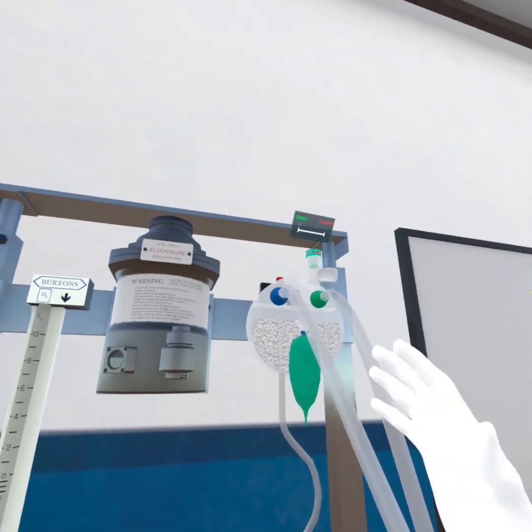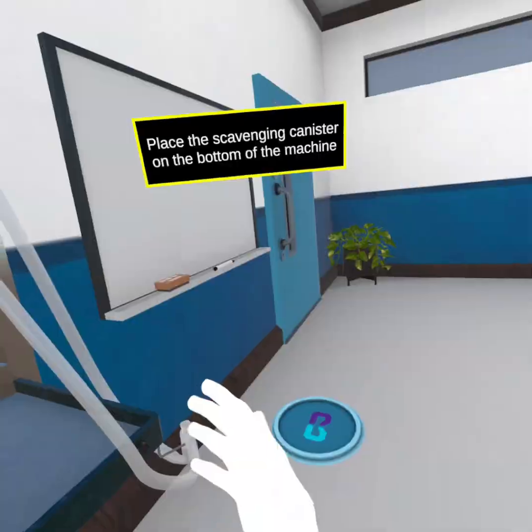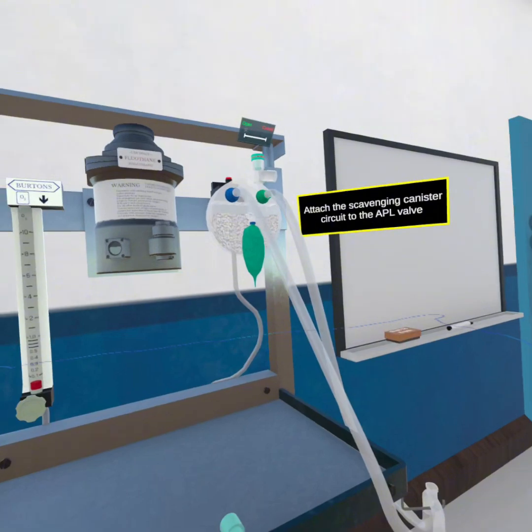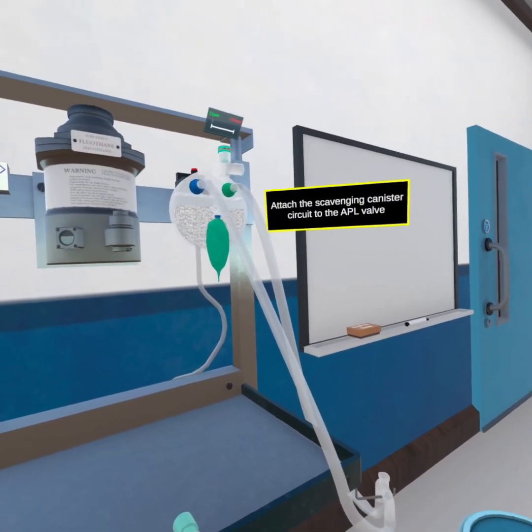Place the scavenging canister on the bottom of the machine. Attach the scavenging canister circuit to the APL valve.